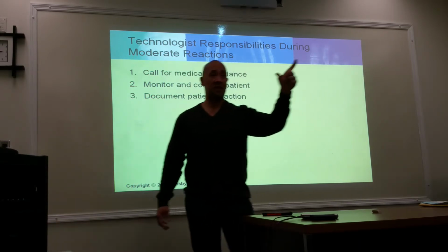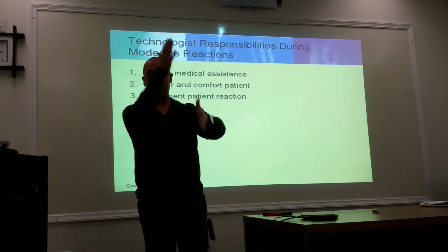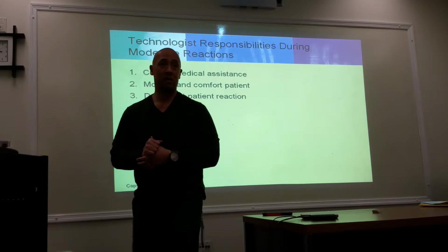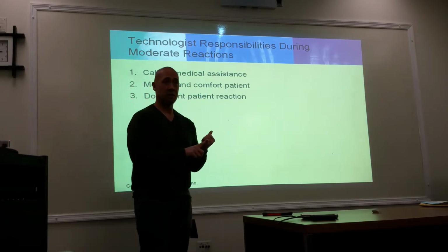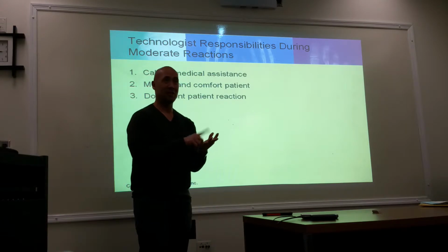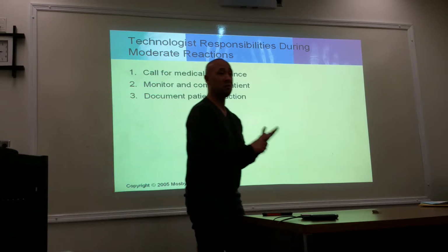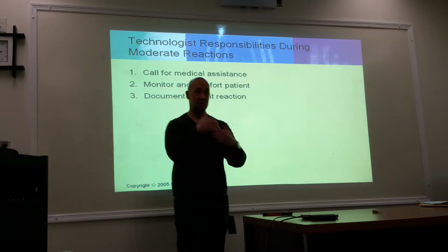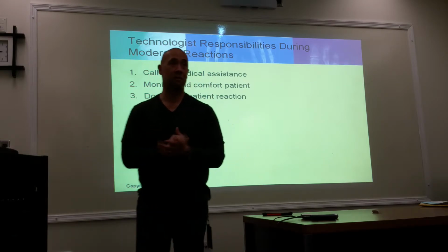And each viscosity is applied to different specific types of procedures, so you want to make sure you've got the correct one. What else are we checking for? Date, expiration, what else? Lot number. Okay, lot number. So you also got to look at the lot number, where it was manufactured. And all this needs to be jotted down on the patient's chart or history form, okay?